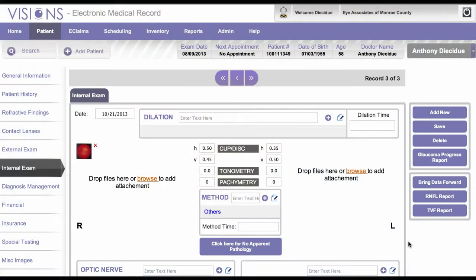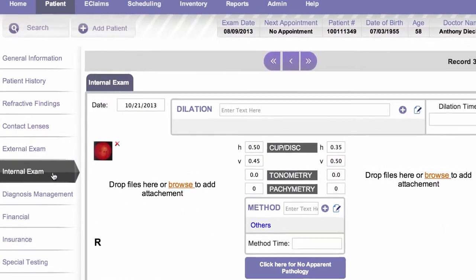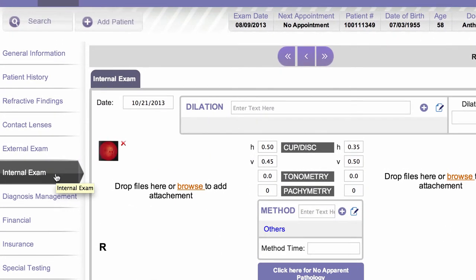The internal examination is where we will record the fundus findings for the patient. To get to the internal examination, first we open a patient record and then we click on the internal exam tab on the left side.